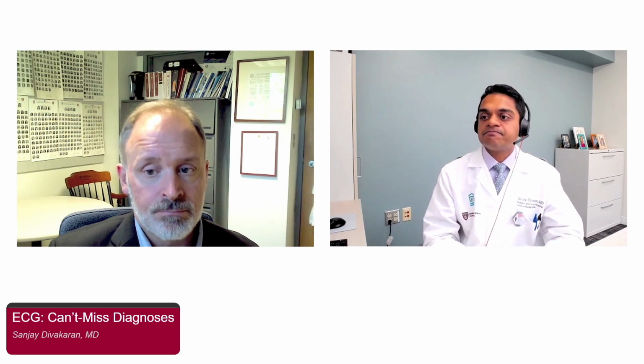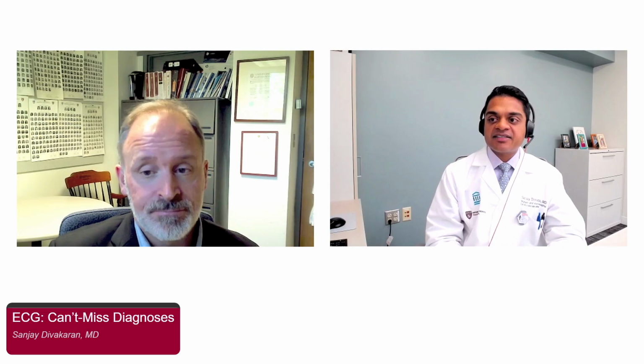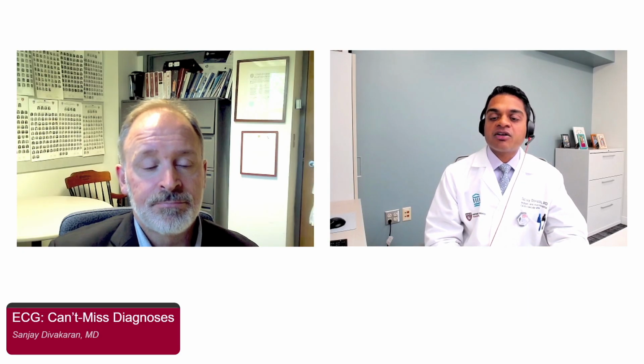Great. How reliable is the calculated QTc on the EKG? Yeah, in general, pretty good unless there's irregularity. I have to be honest, if I have sinus rhythm, it's pretty good. In atrial fibrillation, it really goes awry. And in cases where the RR interval is irregular, I use the longest QT that I can find.